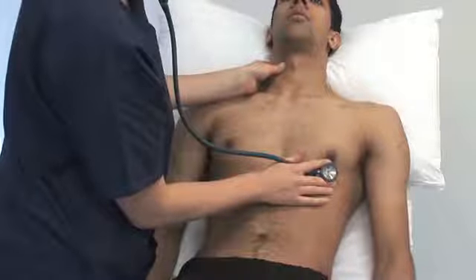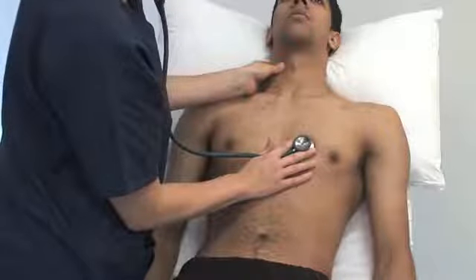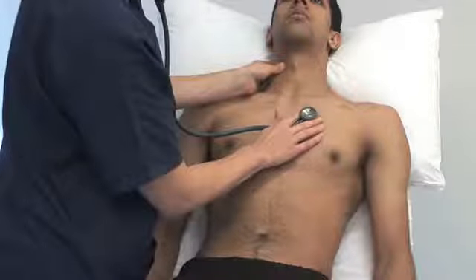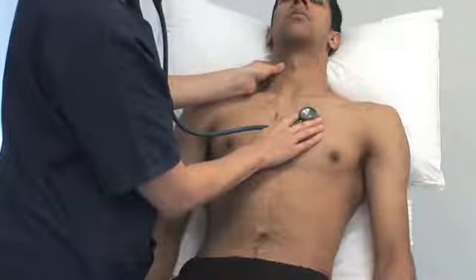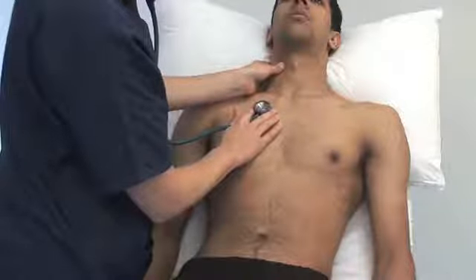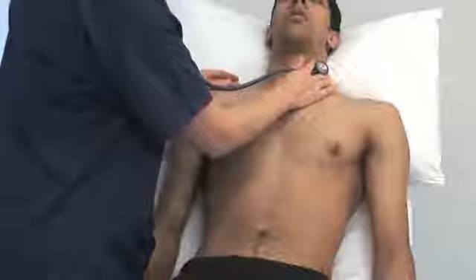Listen at the apex where you felt the apex beat. This is a good site to hear mitral murmurs. The lower left sternal border is the best place to hear the murmur of a VSD. The upper left sternal border is the best place to hear pulmonary valve murmurs, and the upper right sternal border is a good place to hear the murmur of aortic stenosis. Please take a breath in and hold.